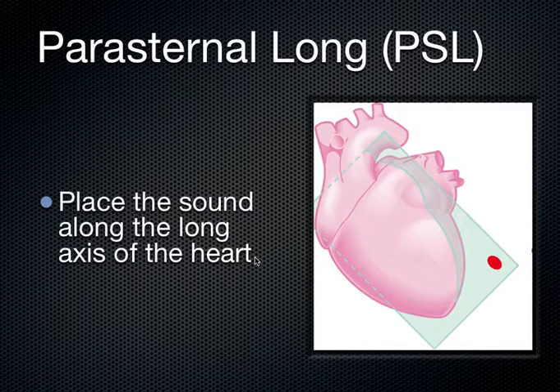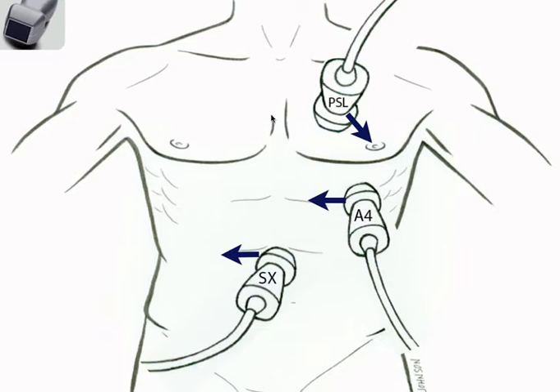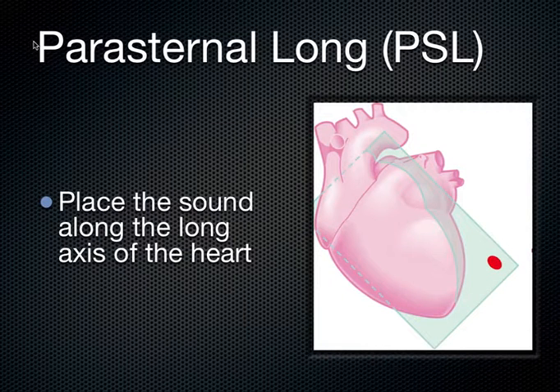To go through these a little more detailed, the parasternal long axis, again, as its name suggests, parasternum, you've got the probe right next to the sternum. So if the sternum is right here, you've got the probe. I actually put the probe on the sternum and then just slide it off a little bit, aiming the indicator toward the patient's left if I'm doing the parasternal long. And this is what the transducer looks like that we use. It's the P21 or phased array, small footprint, 21 millimeters of footprint there right along the parasternal region.